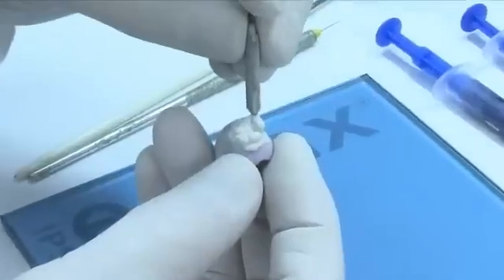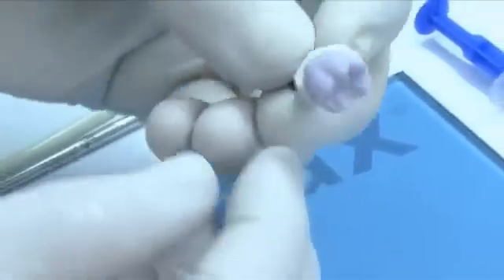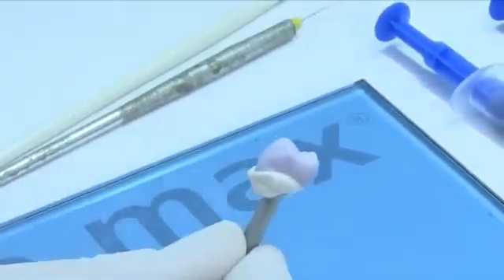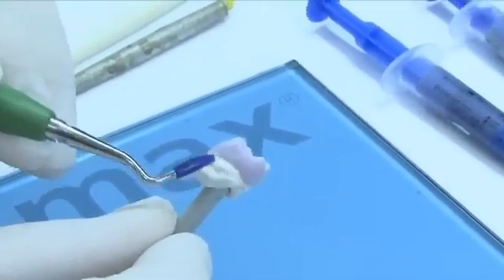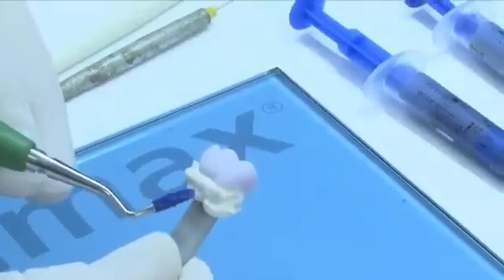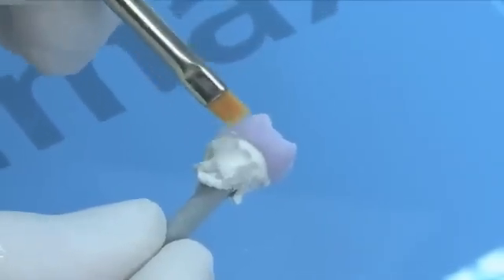Place the wide end of the silicon nitride firing pin deeply into the restoration. Using a spatula instrument such as Optrosculpt, pull the Object Fix down to the firing pin to ensure stability and complete access to the restoration for glazing. Use a wet brush to remove any Object Fix that may be on the external surface of the restoration.